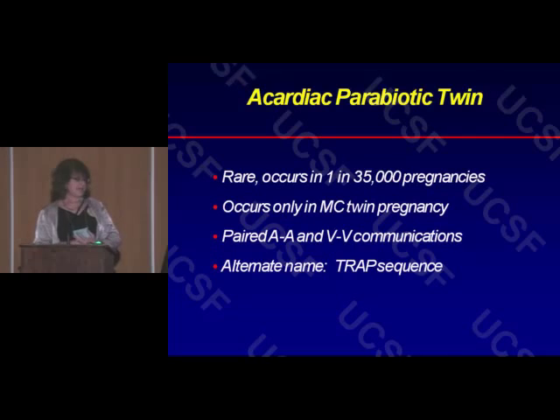A few words about acardiac or parabiotic twins. This is quite rare, but I talk about it partly because it can be misdiagnosed and therefore a late pickup, altering the outcome if it's not correctly identified. If you didn't know that this condition can exist, it's not something you would imagine.